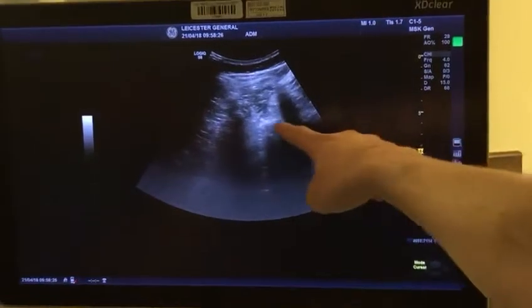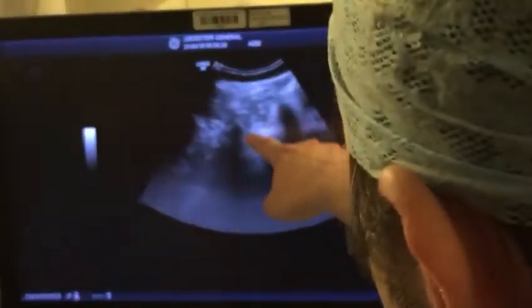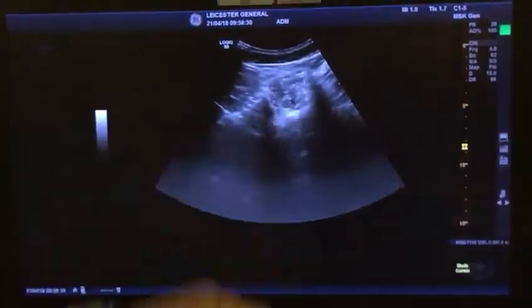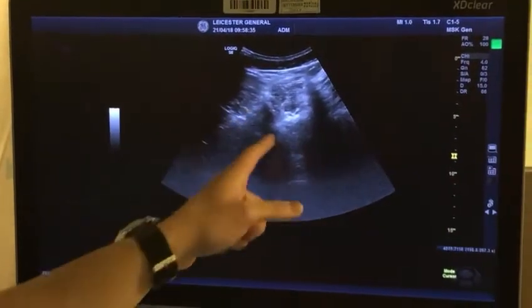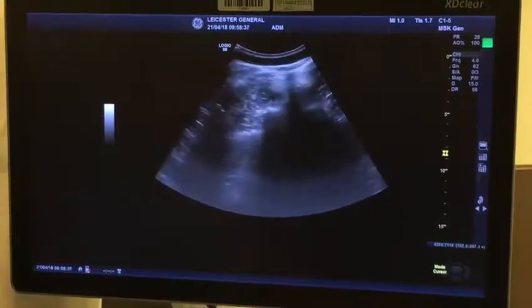So this is lamina. Yeah, that's your lamina. There won't be a facet, right? There will be your sacral ala. So that's for the medial branch. If I keep going up.